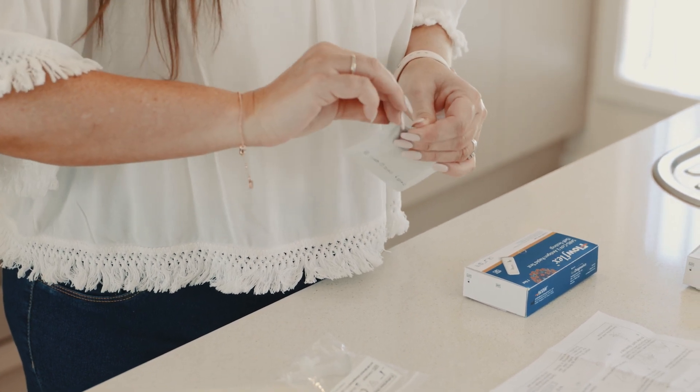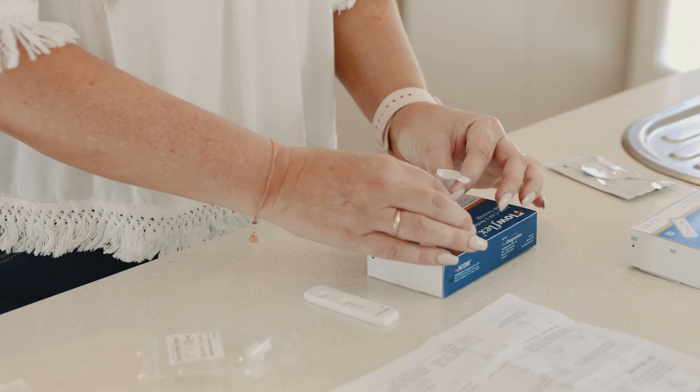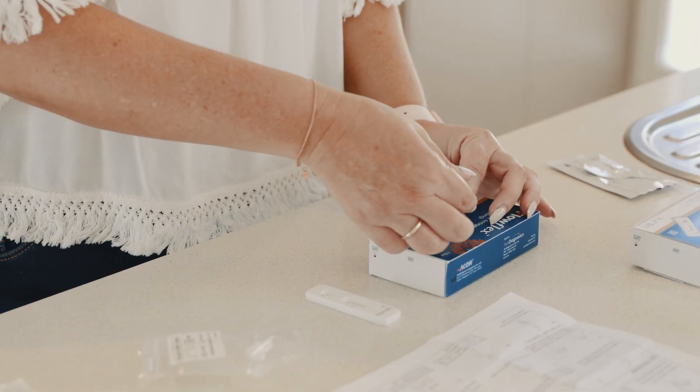Open your test cassette pouch. Carefully peel off the foil from the extraction tube and place it in the hole indicated on the box.